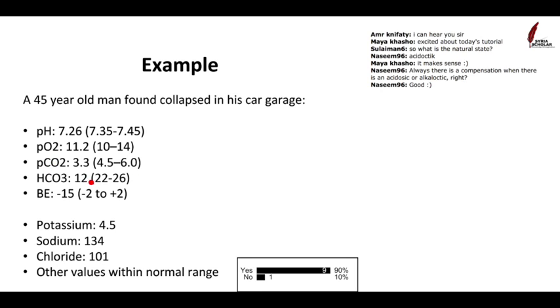Good. The acidosis is explained by the bicarbonate because the bicarbonate level is low, and we know that bicarbonate makes you alkali, so when it's low, it means it's making us acidic. So therefore, this must be a metabolic acidosis. So it's an acidosis that's caused by low bicarbonate.